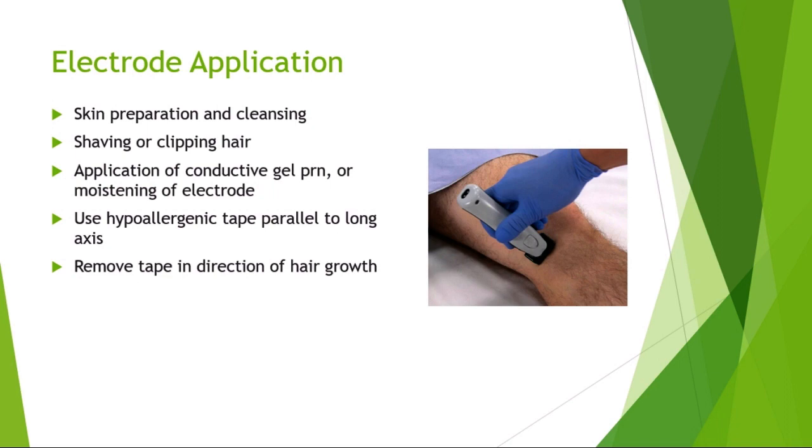Sometimes you might need to apply conductive gel or moisten the electrode to get good conductivity. If you use hypoallergenic tape, you want to go parallel to the long axis of the electrode. And you want to remove the tape in the direction of hair growth. We're not trying to do hair removal with the tape.